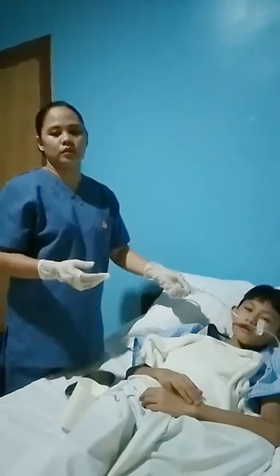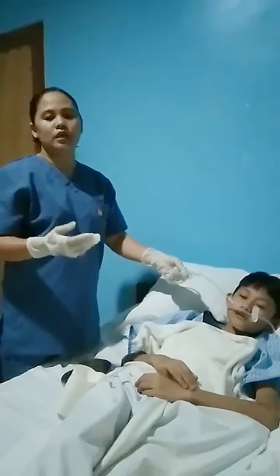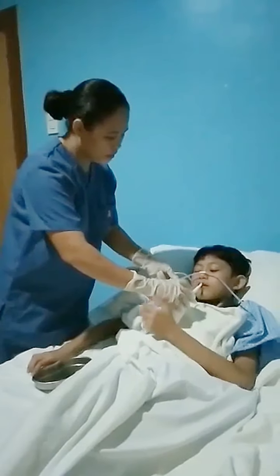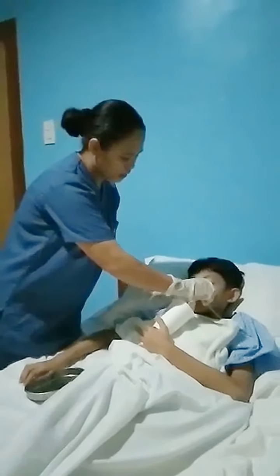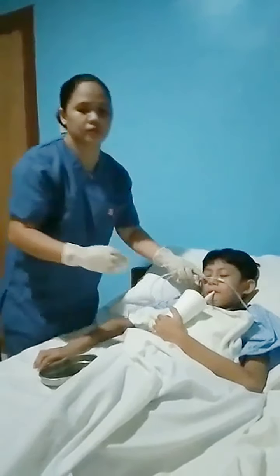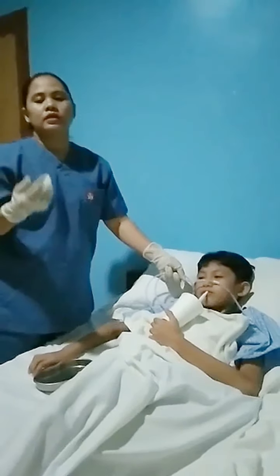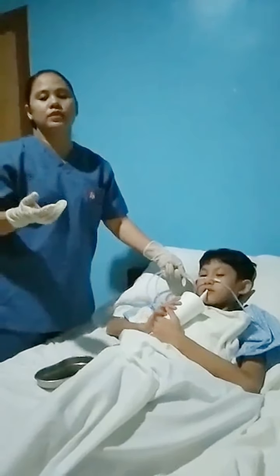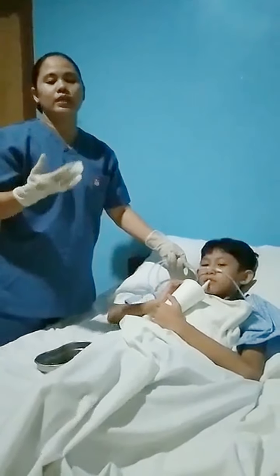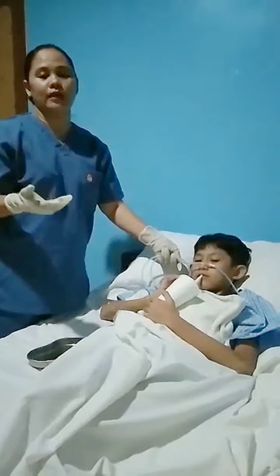After doing that, direct the patient to sip water and advance the tube 10 centimeters with every swallow. Doing that will ease insertion because of the normal peristalsis. Sir, please sip and swallow water. Okay. There will be temporary gagging that would subside after you advance the tube. Once the tube is in, we need to secure the tube temporarily.